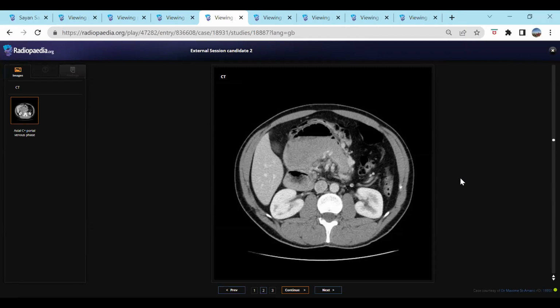So in my normal clinical practice, this person needs urgent intervention. So I would pick up the phone and I would inform the surgical team on call. Okay, that is fine. So what are the complications that you will try to rule out? I would want to look for any non-enhancing segments of bowel, to look for any ischemia. Okay, one next. Any signs of perforation. Right, that's it. I think those are the two most important things.